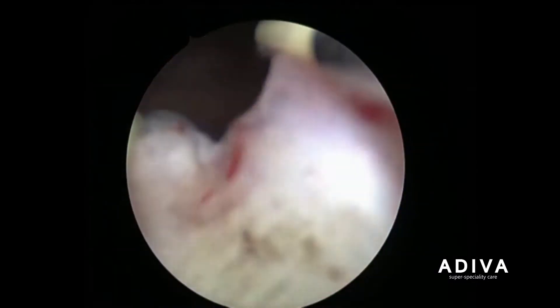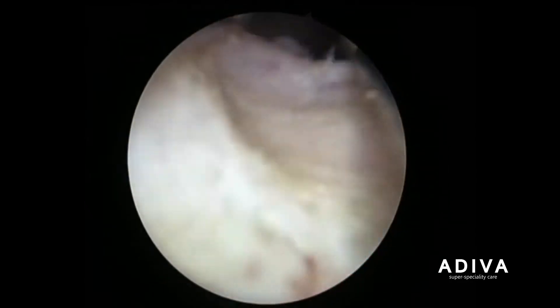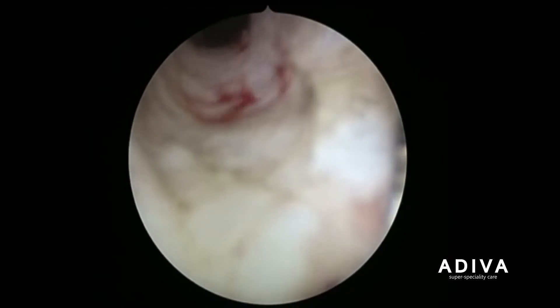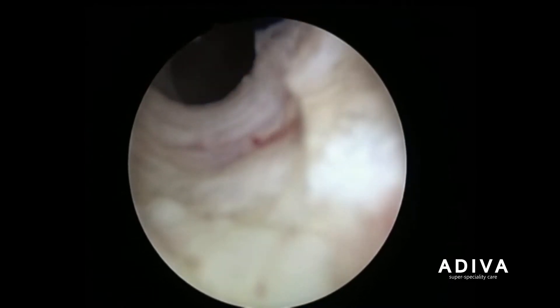Prostatic enlargement is a very common condition and the gold standard treatment for removal of the gland when surgery is required is a transurethral resection of the prostate gland. Here you can see the procedure known as transurethral resection of the prostate, or in short form, TURP.